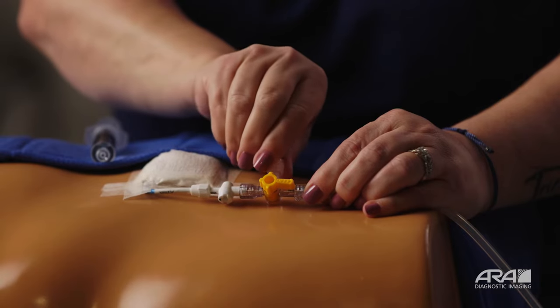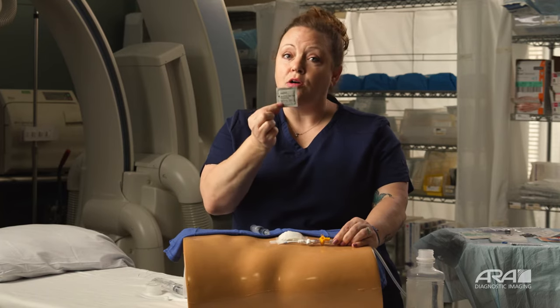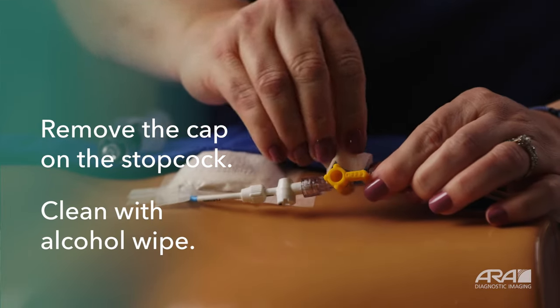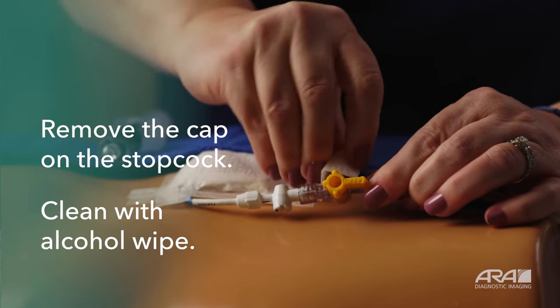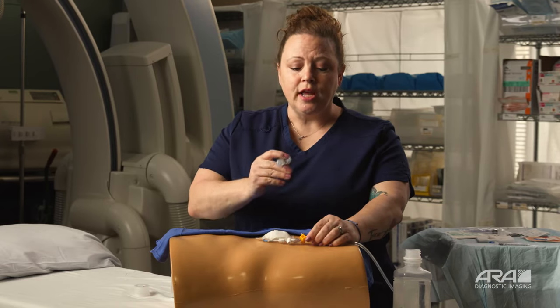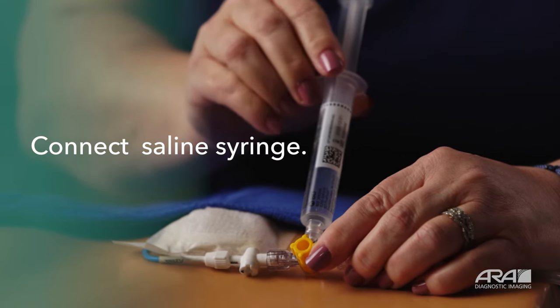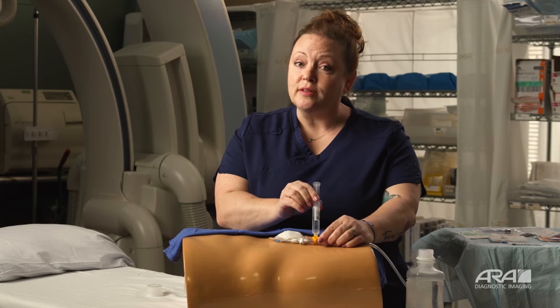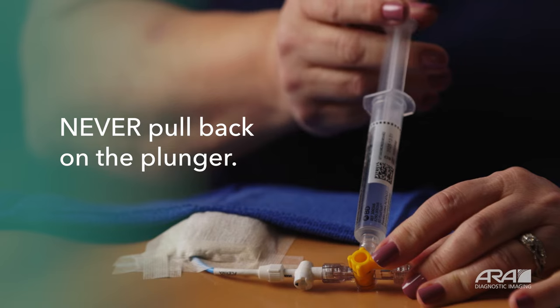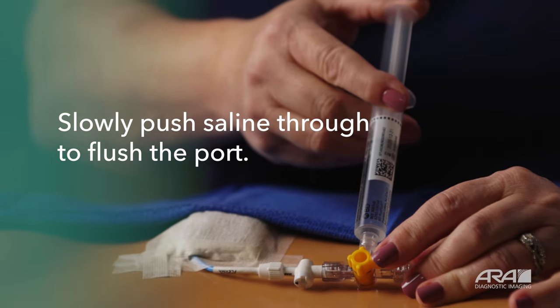Remove the cap and clean this port — this is where you'll want to use one of your alcohol prep pads. Open your prep pad, grasp the end, and slowly turn and clean the entire port area. After you've cleaned your port, take your normal saline syringe and firmly insert it into the port. You'll turn until it is connected — you do not need to over-tighten, as this will make it difficult and frustrating to remove. Turn until it is secure. Never pull back on your plunger once connected to your drain.